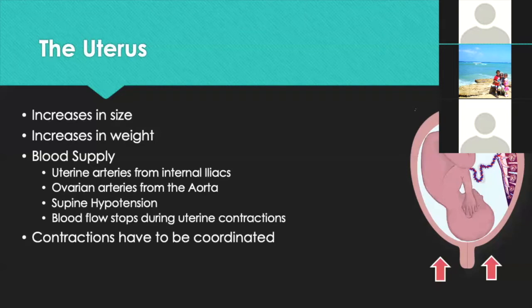Just get her to push. Yes, pushing is much better when there's a uterine contraction. But if there's a prolonged deceleration, A, flip the bed. She's probably in too much supine for the happiness of the baby. And B, if you really want this baby out, just get her to push. Uterine contractions are a factor that helps you deliver the baby. It's not the only one. Maternal effort is important. Remember, you're pulling from the other side as well. So get that to work with you, rather than getting the uterus to clamp the baby in, hold it so it can't come out, and make it more hypoxic. Does that make sense?